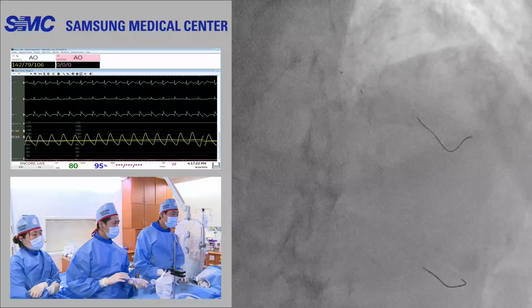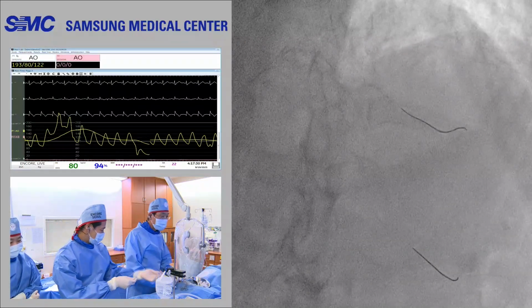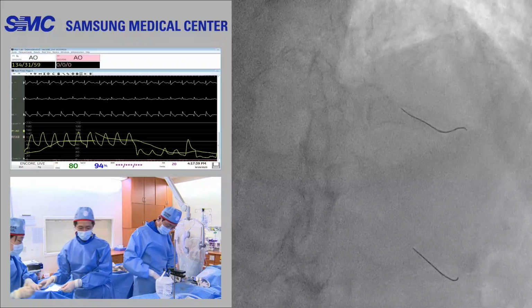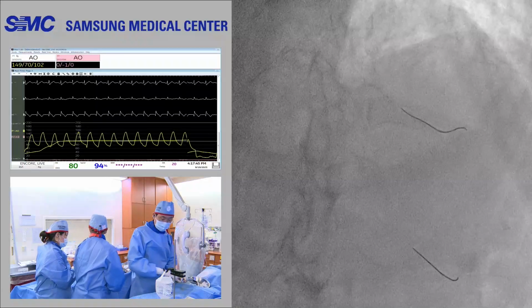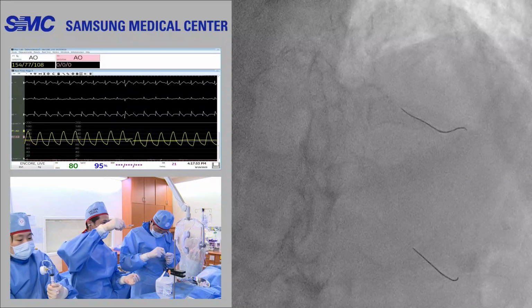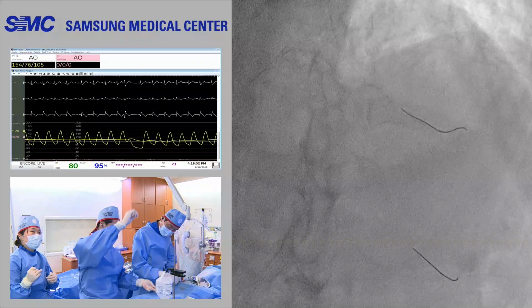Okay, so I'm allowed to use contrast. Dr. Hong is watching us. Now it's time to mix your contrast with saline 1-to-1. After the diagonal cutting, you can do angio after the second cutting on the diagonal. Just to save contrast, to reduce contrast, just checking the IVUS is enough, I think. Dr. Hong always refused to show us the angiography, and now your position is different.